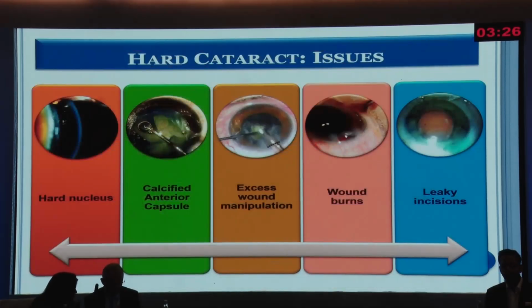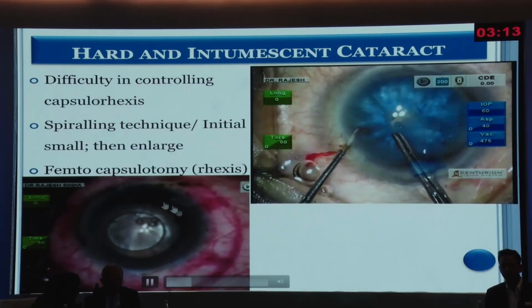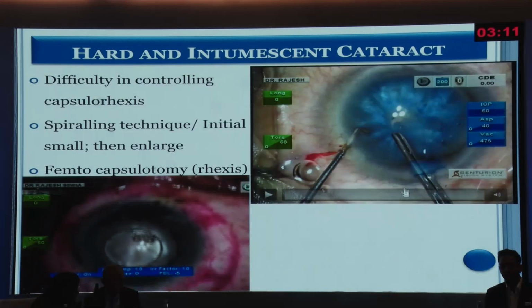A word about hard cataract. There are many issues with hard cataract. There can be a calcific capsule, there can be wound burn, etc. If you have a calcific capsule, you can do a femtosecond laser assisted free floating capsulotomy, and that works well.